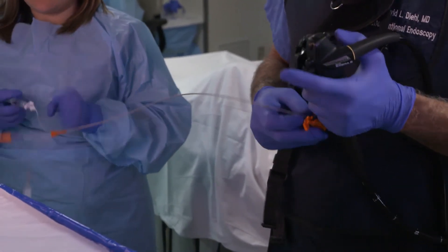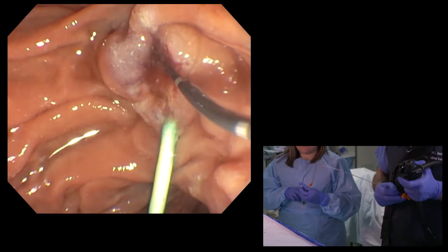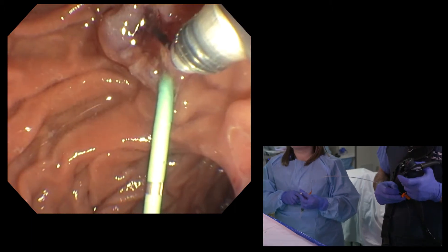That balloon goes from eight and a half to fifteen millimeters, so you have a huge range of sizes, but we'll go for the eight and a half.